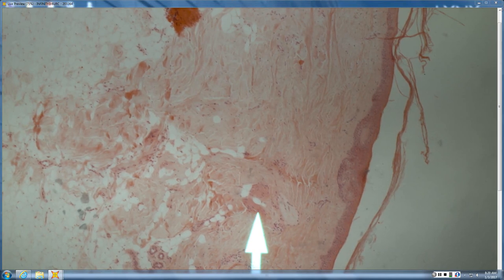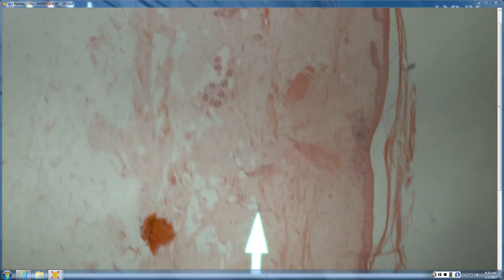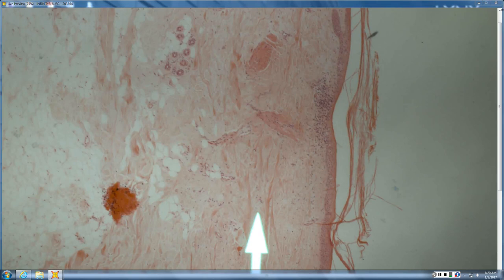They're absent. You're thinking probably scarring alopecia. It's too far gone for me to really tell exactly what it was. So the question is, is it too far gone to tell you what it was? There's some lichenoid infiltrate sitting right over an erector pili, and then some actual infiltrate in the erector pili as well, it looks like around the unit.